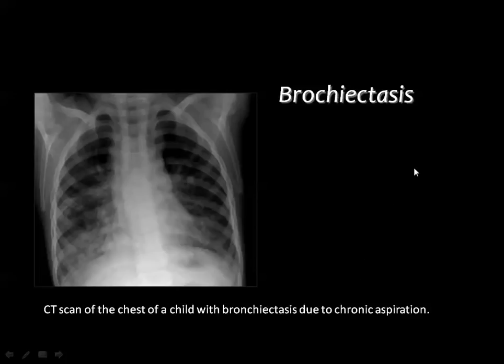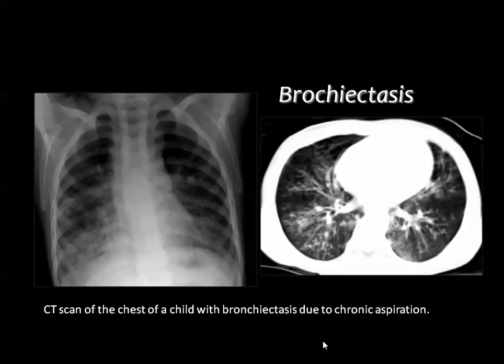Then one of the complications of pneumonia, if it persisted for a long time, is the development of bronchiectasis within the underlying lung. There was a very old technique known as bronchography in order to confirm the diagnosis of bronchiectasis whenever it is suspected clinically.